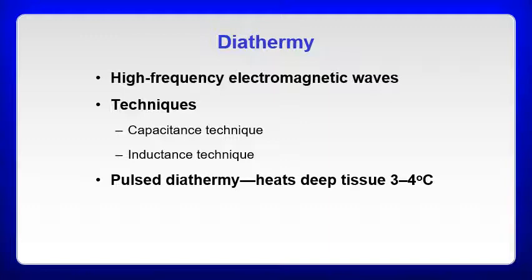And when you're looking at this, most of the newer units are strictly just pulsed diathermy units. Now, this is the unique thing compared to ultrasound. With diathermy, there are units that are strictly pulsed. With pulsed diathermy, you will still get your tissue temperature increase. If you want, you can also utilize pulsed diathermy for non-thermal purposes. But some units are just strictly pulsed diathermy, and you can still get heating effects with that, unlike with ultrasound, where you wouldn't utilize it in that fashion.